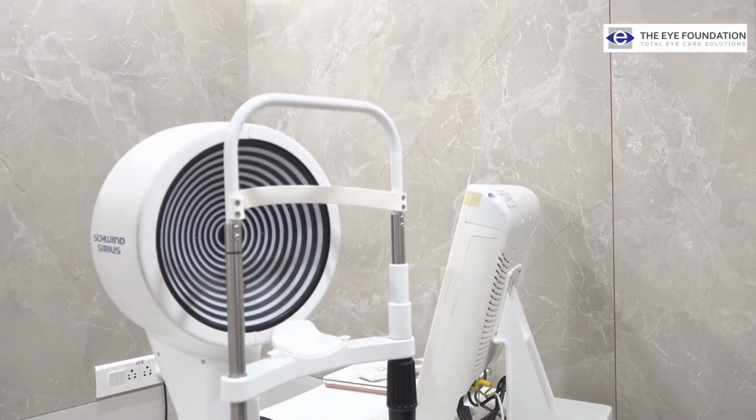First the patient's refraction will be done. Refraction means we check the power of the patient, and then topography, a series of corneal maps, will be taken, and mainly we look at the corneal thickness of the patient and then decide whether the patient is eligible for LASIK. So who all can undergo LASIK?